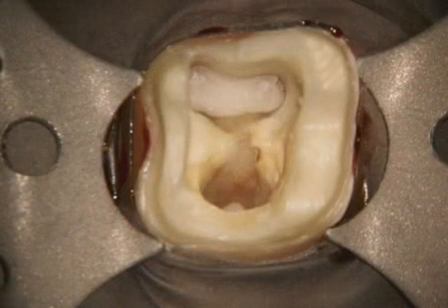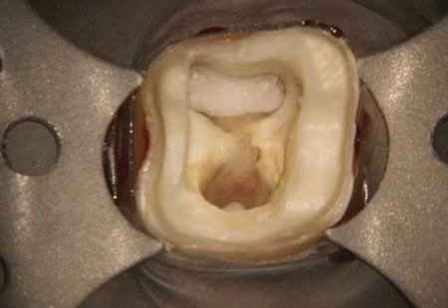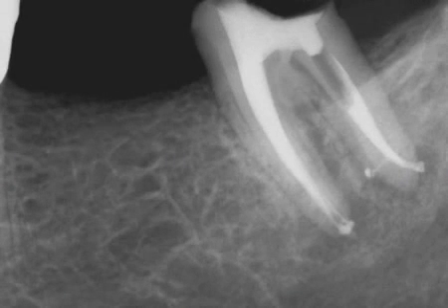In this case, the principles of wet bonding are applied, and a photograph shows the perforation repair utilizing a dual-cured composite resin restorative. Once the defect is repaired, the canals are cleaned, shaped, and a cone-fit film reveals the canals are ready to pack. A post-treatment film demonstrates the calcium sulfate barrier in the bone, the furcal repair, and three-dimensional obturation. A 5-year recall film shows the new bridge and osseous repair furcally and apically.